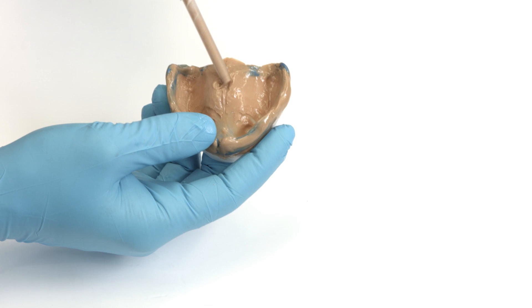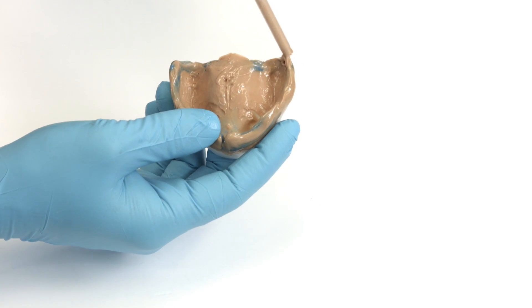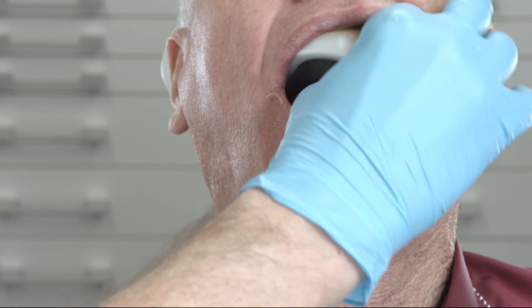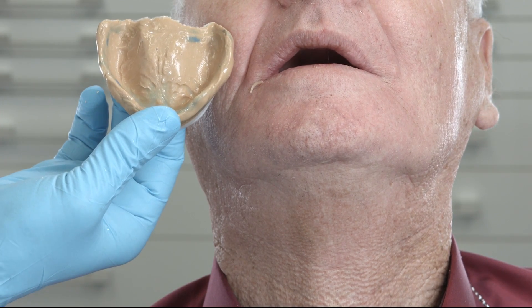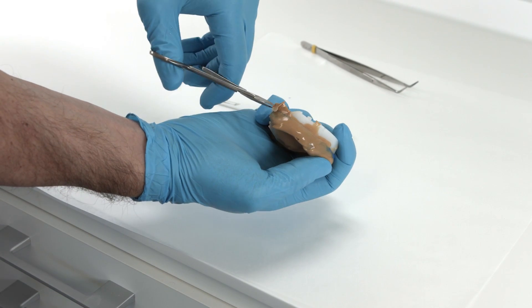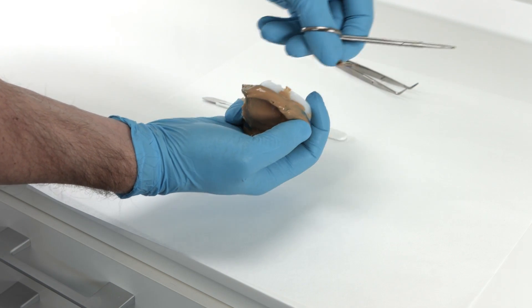Small voids and inaccuracies can be corrected with Virtual Extra Light Body. For this purpose, proceed in the usual way. When the tray is removed, the suction effect should be perceptible. All the important anatomical details should be visible without any voids. Excess material must be removed, in the area of the tuberosities in particular.